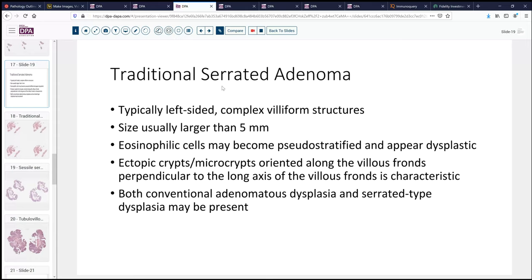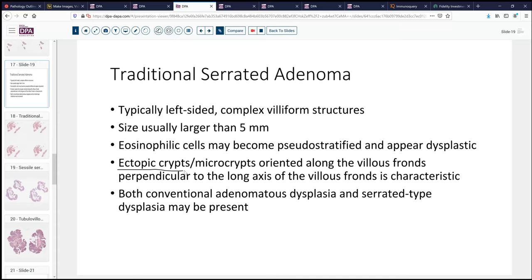This lesion is most commonly confused with a villous adenoma, because these are usually left-sided and they do have a complex villiform architecture. They're usually large and composed of eosinophilic, not usually dysplastic epithelium, although dysplasia can develop. One of the most helpful features to find is the presence of ectopic crypts or microcrypts that are oriented along the villus fronds. In these lesions, you can get both conventional-type adenomatous dysplasia as well as so-called serrated-type dysplasia.